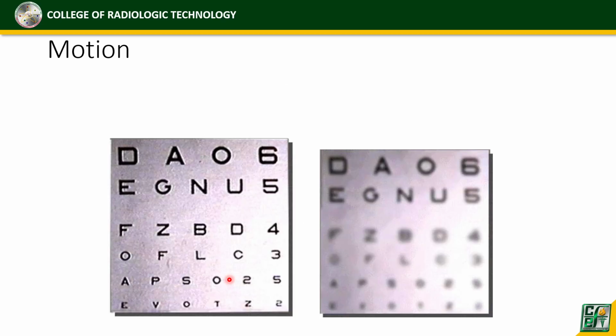Then of course, motion. Siyempre, motion is the number one enemy. Yan ang number one enemy natin kapag tayo ay nag-perform ng any radiographic examination. Kasi once na gumalaw ang pasyente, magkakaroon ng unsharpness.